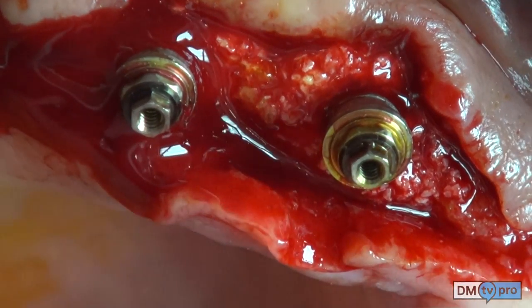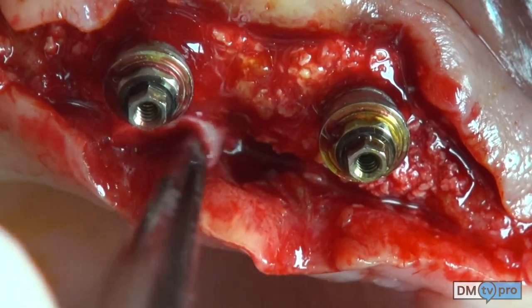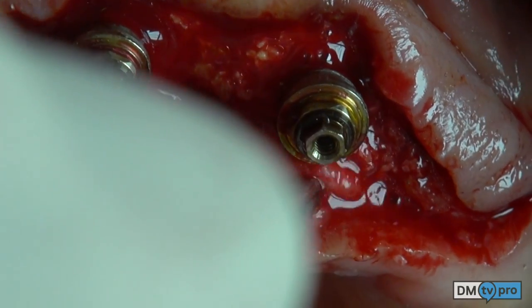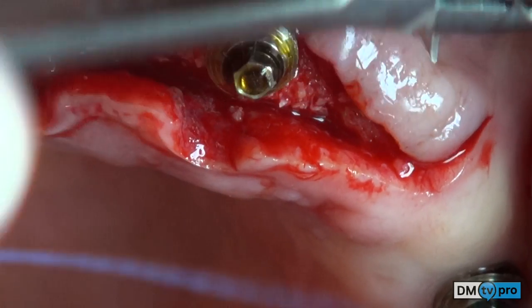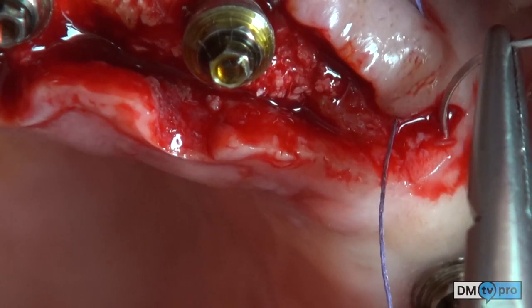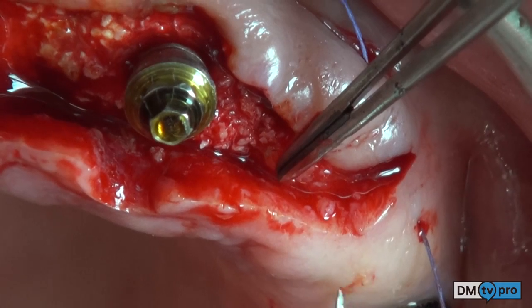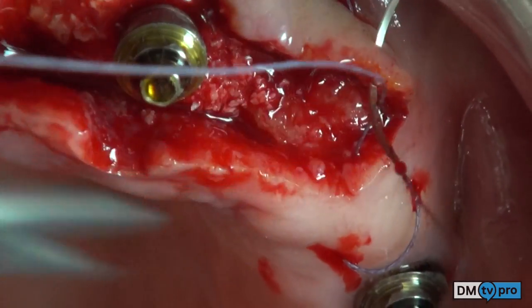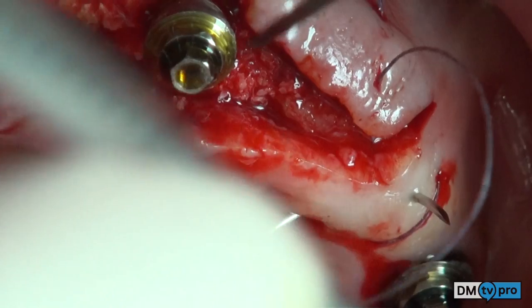A medical collagen sheet is placed on top of the biomaterials on the palatal aspect in order to withstand the soft tissue pressure from the palate. Resorbable sutures are used to secure the flap. The Toronto Bridge will be repositioned at the end of surgery, so the resorbable sutures will make suture removal easier after two weeks.